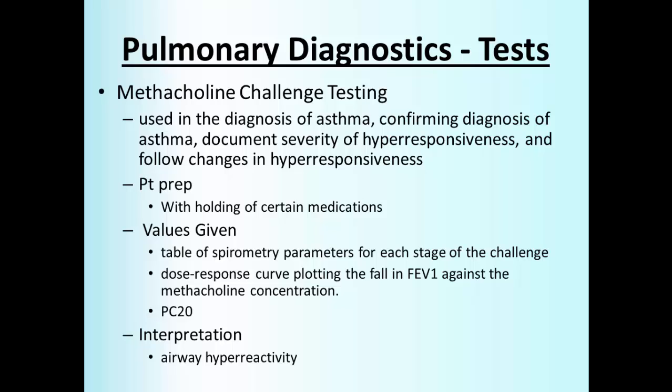Typically, they look at a 35% fall in specific airway conductance, or the SGaw, to denote the presence of airway hyperactivity when technically good spirometry cannot be obtained. Failure to demonstrate bronchial hyperactivity does not totally exclude asthma, particularly asthma triggered by occupational exposure to chemicals.